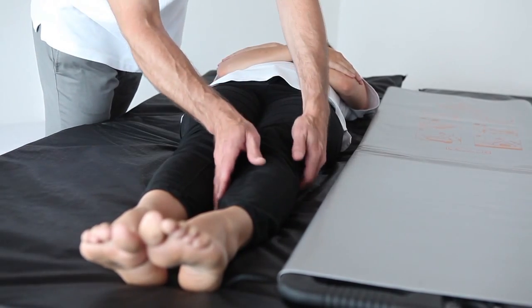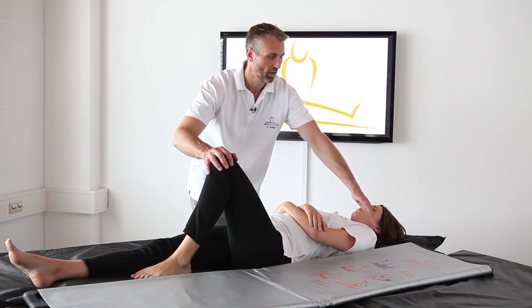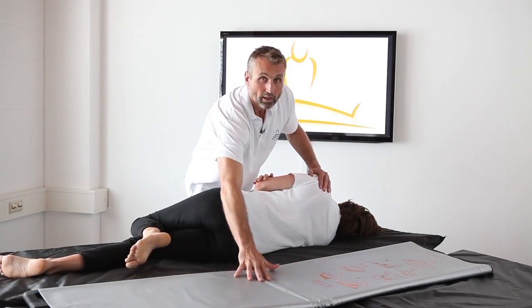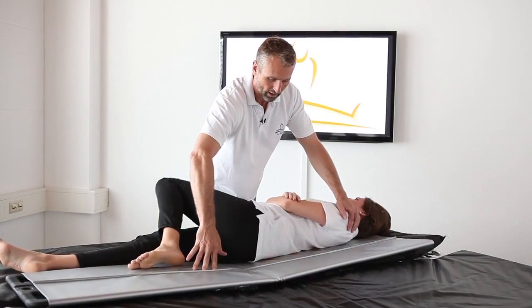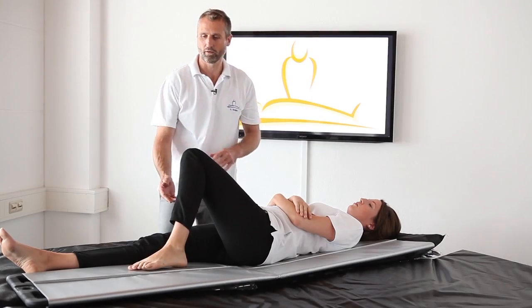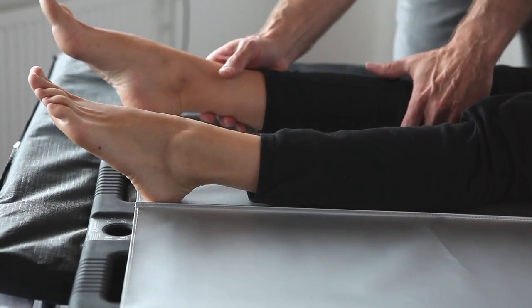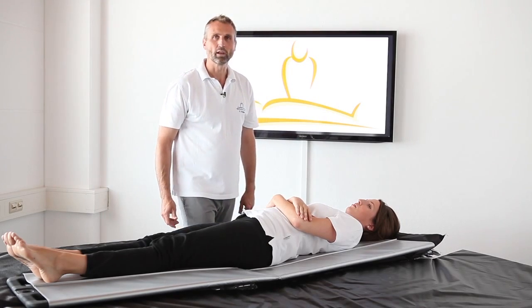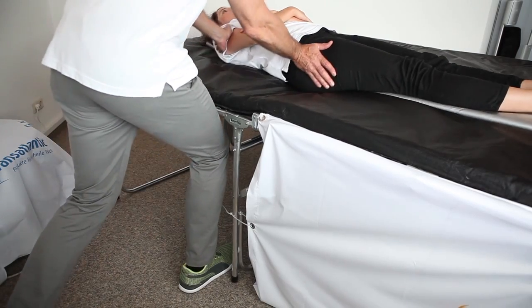Firstly, we need to roll the patient to the side — take her on shoulder and knee. Secondly, bring the board underneath the patient. Roll it to the back and then, thirdly, roll the patient back onto the board. Put legs and head on the board and then you only need to gently push on hip and shoulder.